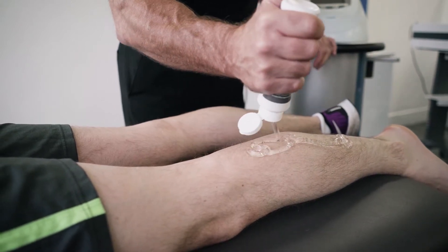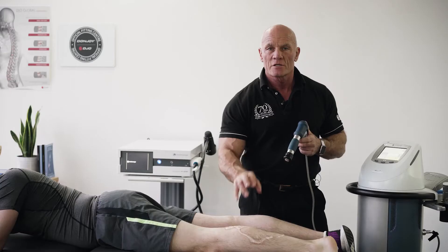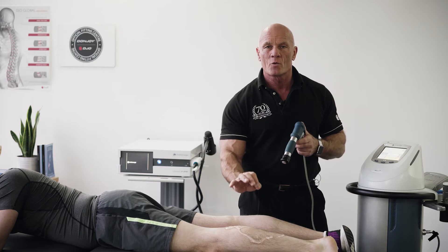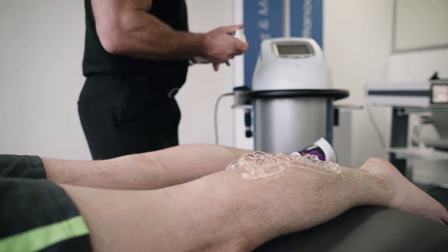Firstly, in order to ensure good outcomes with radial pressure wave, you use plenty of gel. Sound waves travel well through water, not through the air, so you must use a lot of gel.